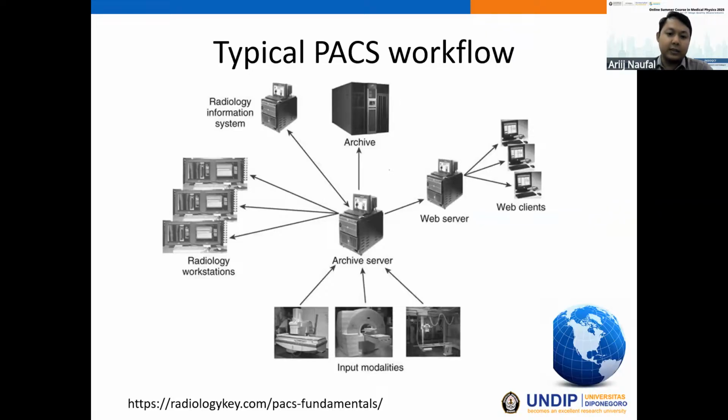Okay, this is the diagram for the typical PACS workflow. We can see here that PACS usually has the main server as an archive in the middle, and this is the main archive, directly connected to the server. And they have a web server. The web server can be accessed from multiple web clients to view or evaluate the images.